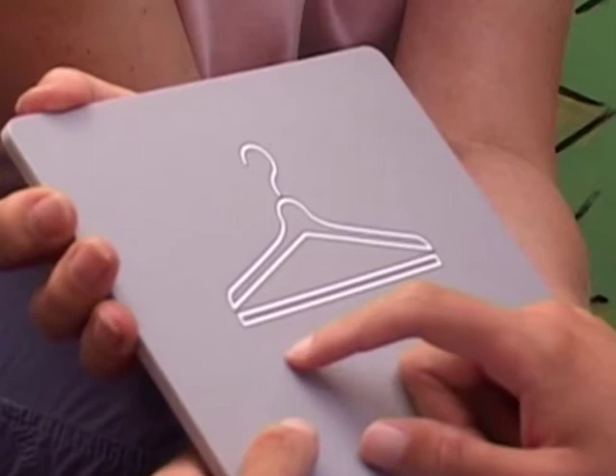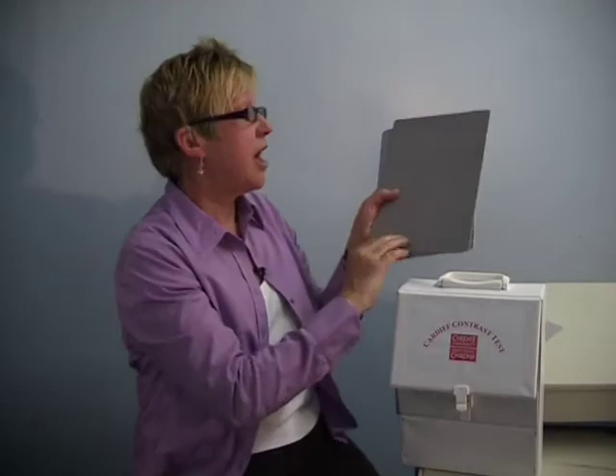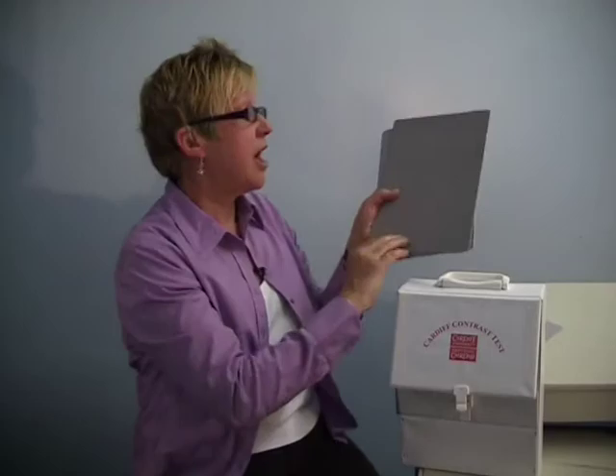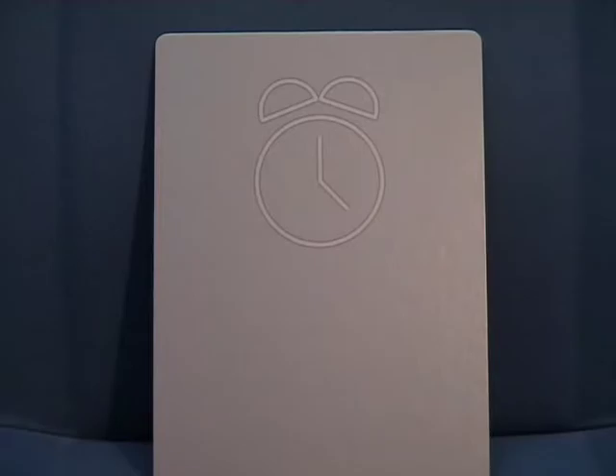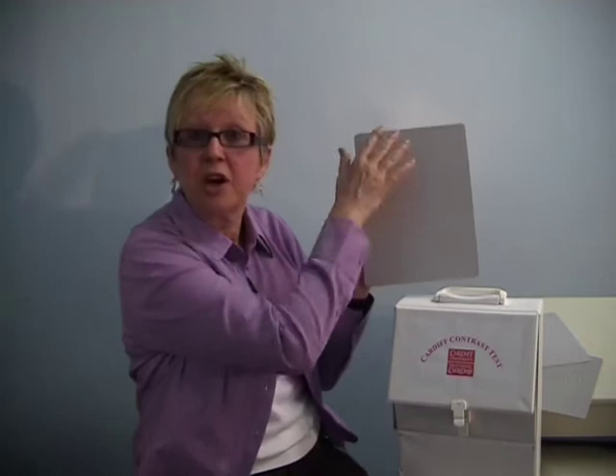The Cardiff contrast test is similar in principle to the acuity test. We use the same pictures — pictures that are familiar to young children in the children's version, and adult-appropriate pictures for the adult test. This time we have dark grey and light grey making up the outline. As the contrast reduces, the pictures get fainter and fainter, until when our contrast sensitivity is no longer good enough to see the picture, the whole picture looks blank. We don't have a set distance for the contrast test, because the appropriate distance will depend entirely on the patient's acuity level. We're trying to measure the patient's ability to see large but faint targets, so the target needs to be well within the patient's acuity limit, and the distance may be very close.